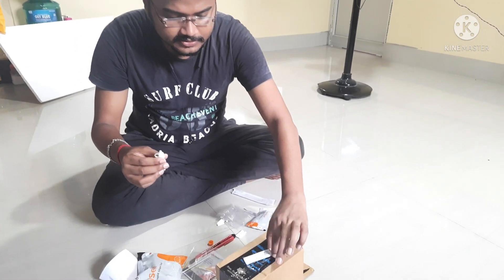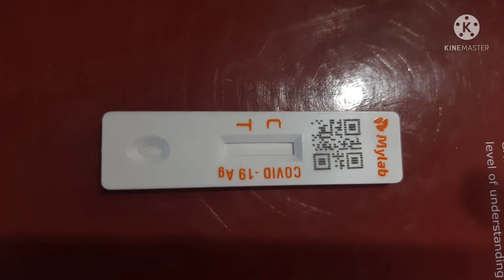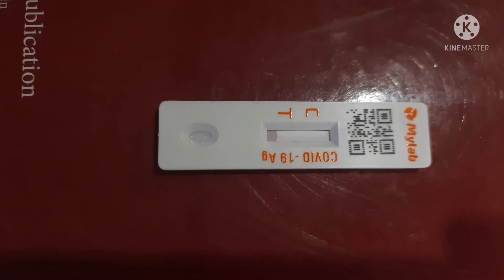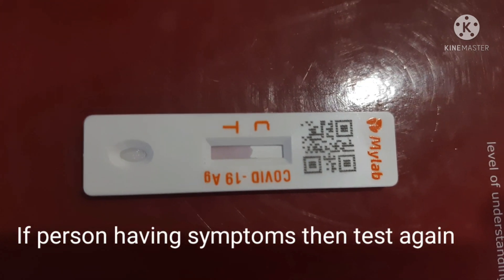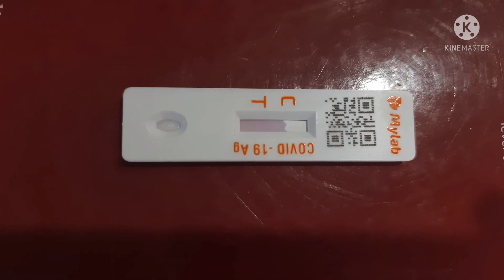The nasal sample and the solution are now completely mixed. We need to put two drops of the mixed sample solution onto the test kit at the particular groove. After adding the drops, we have to wait for 15 minutes to get the actual result. Let's wait for 15 minutes for the COVID test report.